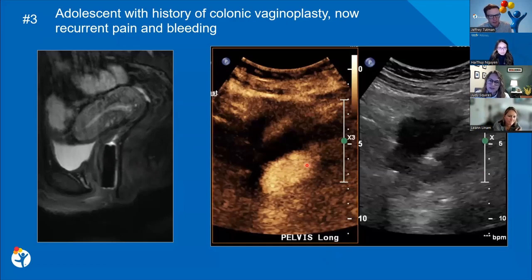Not a ton, just a few cases. I know Harriet has done several, the anorectal malformation patients for preoperative planning. So some places do it. Those are beautiful. We are doing it for newborn anorectal malformations, but we haven't been doing it for cases like this. I think they either get an IR study or just a fluoro VCUG.